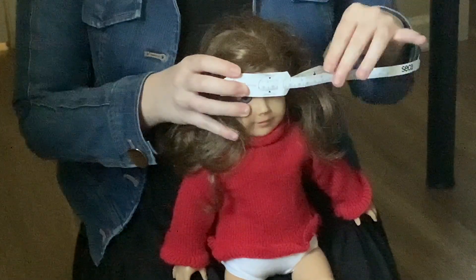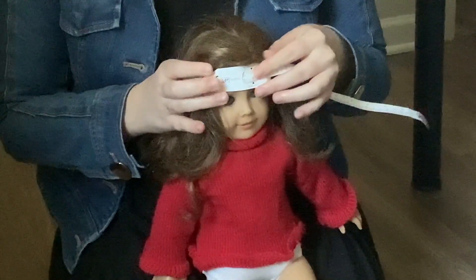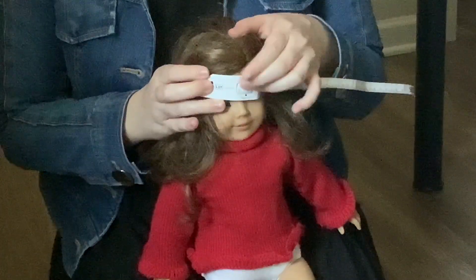Once it's in position and your helper has secured the baby's arms, you are going to want to pull the tape so that it is tight but not painfully tight against the baby's forehead.